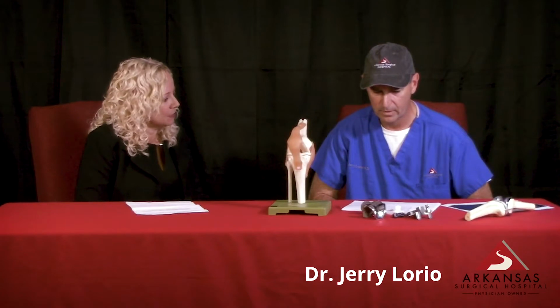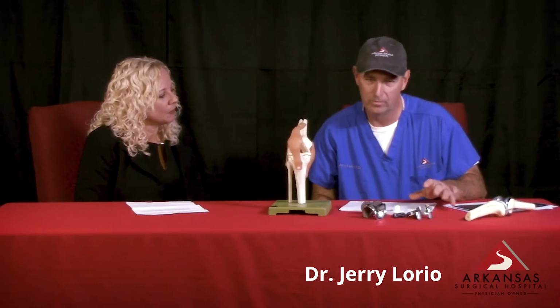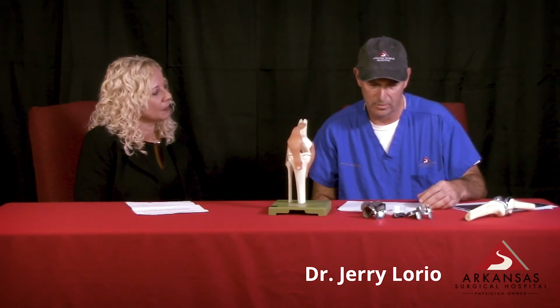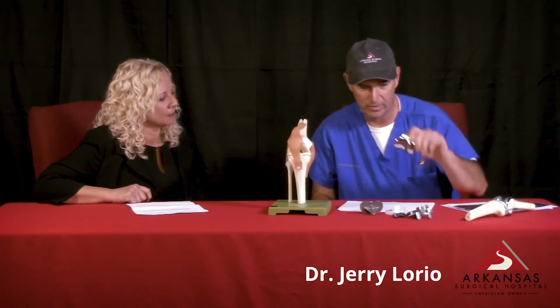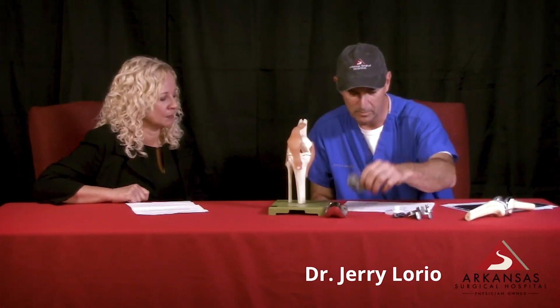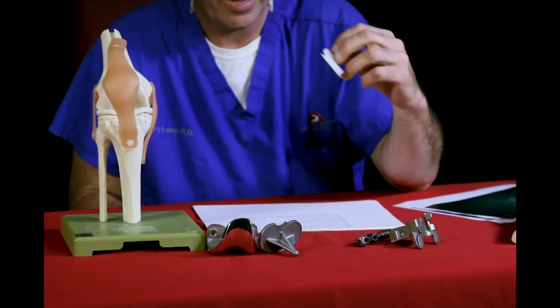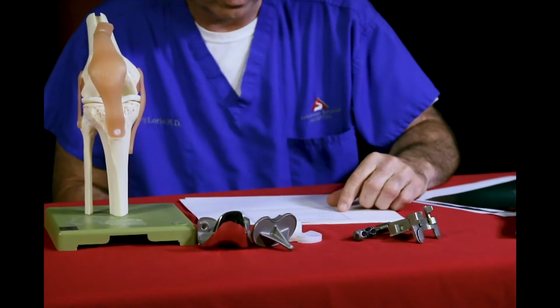Well, thank you. We've had a lot of good questions today. So you brought some information. Do you have something you want to share with us, some data? Just some of the variables. The traditional variables 20 years ago, and I'm going to talk about my practice, when we walk into a knee surgery, you're either going to use a left or right knee. The femur comes in multiple sizes, tibia multiple sizes, the patella component in multiple sizes, and the spacer comes in multiple sizes. At ASH, they actually let us use 1 millimeter difference instead of 2, so that's something unique to Arkansas Surgical Hospital.